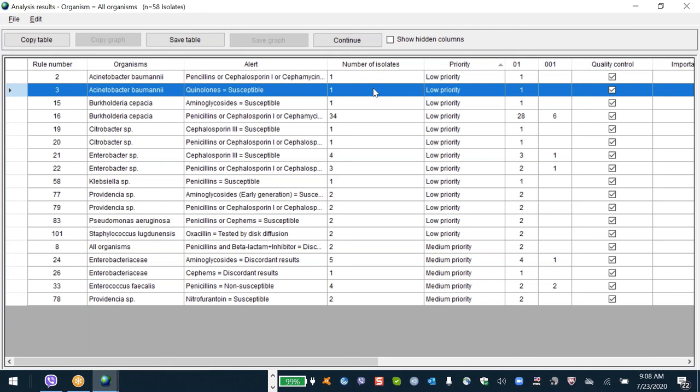But if the patient's going to be treated with ampicillin for 3 or 4 or 5 days, the bacteria might become resistant a few days later, especially if the gene is present but not being produced, because it's just an inactive gene. But after 2 or 3 days, by selective pressure, the gene may turn itself on again. So these are some therapy issues where intrinsic resistance is very valuable. If it's intrinsically resistant but the lab results say sensitive, you still probably really want to avoid it and not tell the doctor to give it to the patient.